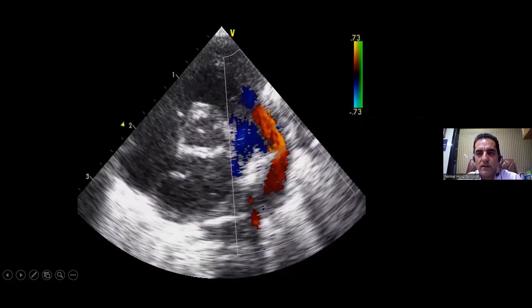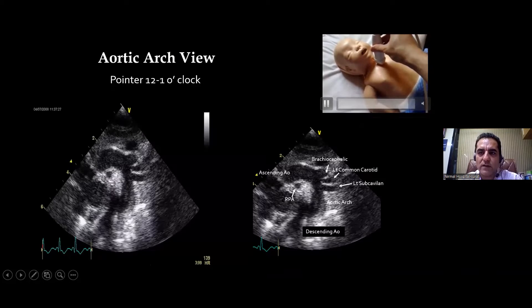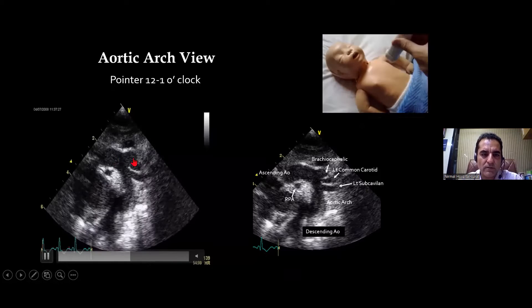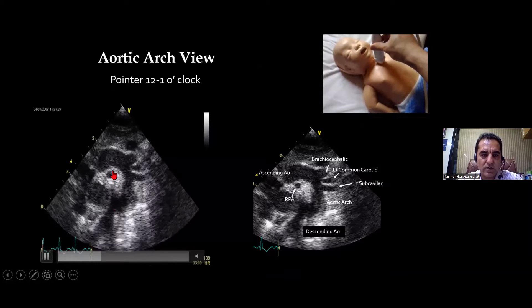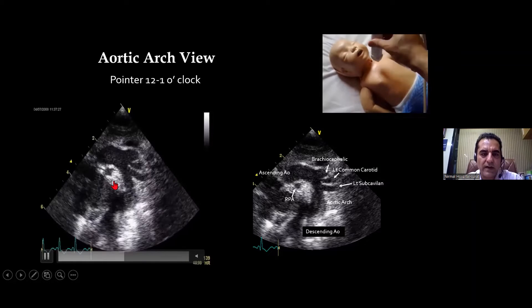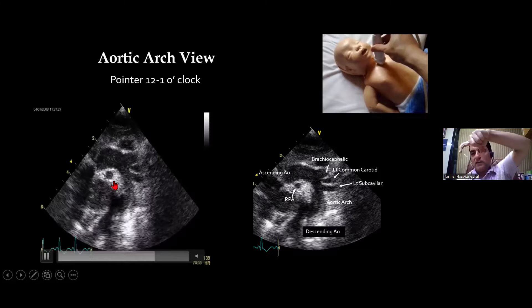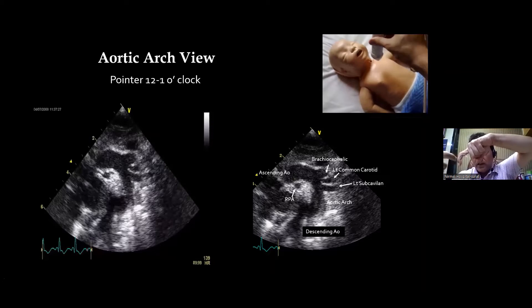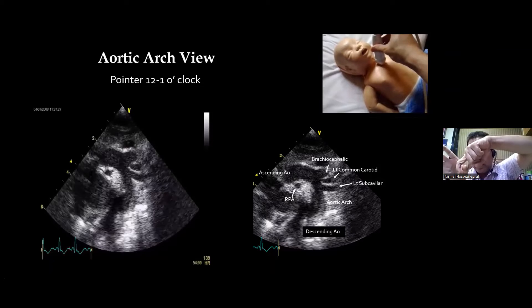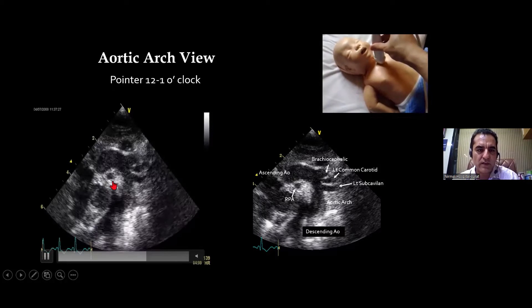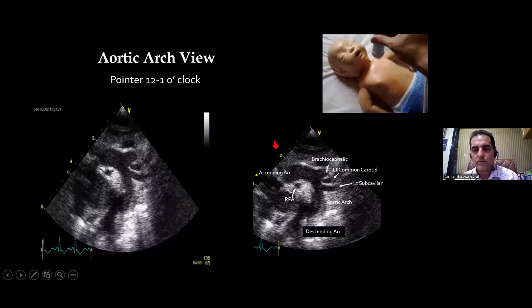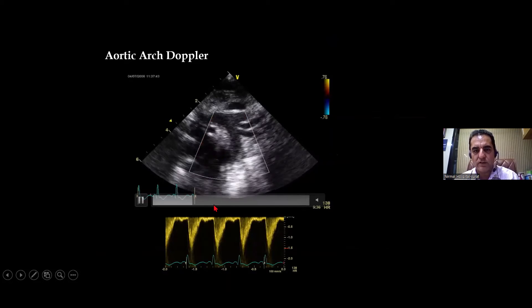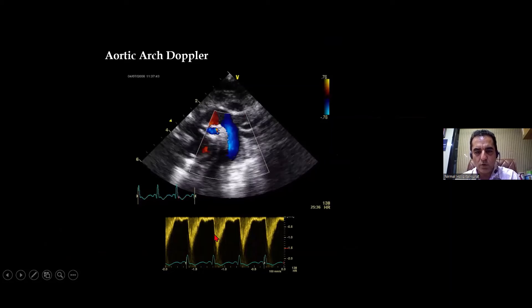From the right subclavicular or suprasternal notch view, with the pointer at 12 to 1 o'clock, we visualize the aortic arch: ascending aorta, aortic arch, and descending aorta. The structure you see is the right pulmonary artery, because the aorta runs longitudinally while the pulmonary artery crisscrosses it — so the RPA is cut cross-sectionally. With color Doppler, blood flows away from the probe, appearing blue, and the Doppler trace falls below the baseline.